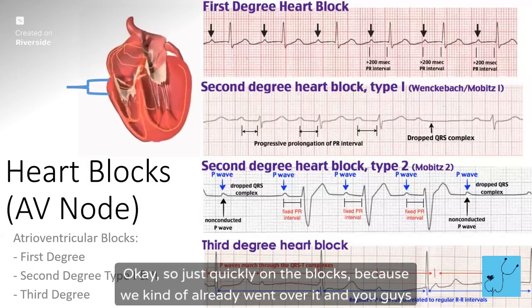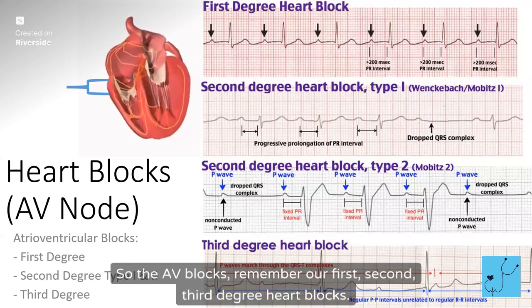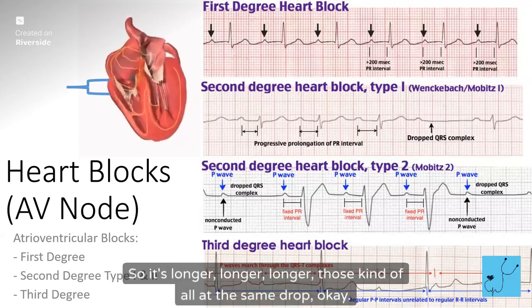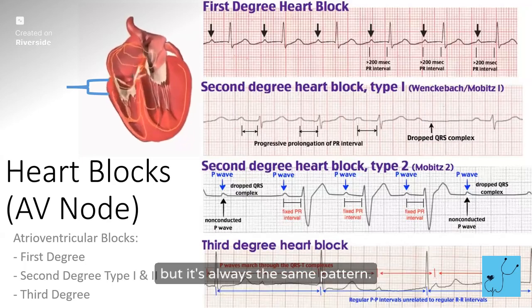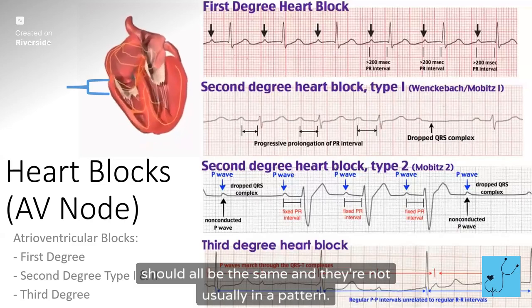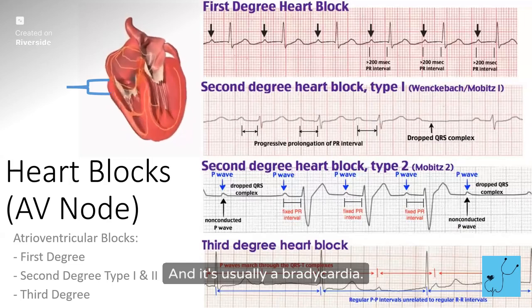Okay, so just quickly on the blocks, because we kind of already went over it and you guys seem to have a pretty good grasp of it. So the AV blocks, remember, are first, second, third degree heart blocks. So here we have the prolonged PR, and then we have the type 1, which is the wink with one eye, Wenckebach Mobitz 1. So it's longer, longer, longer, then drops, but it's always the same pattern. And then the second degree type 2 is the random dropping of complexes, but your PRs should all be the same, and they're not usually in a pattern. And then the third degree, the P's march out and the QRS's march out separately of each other. And it's usually a bradycardia, okay?